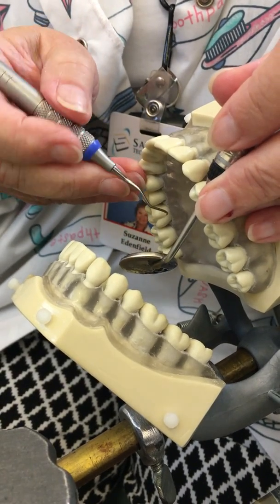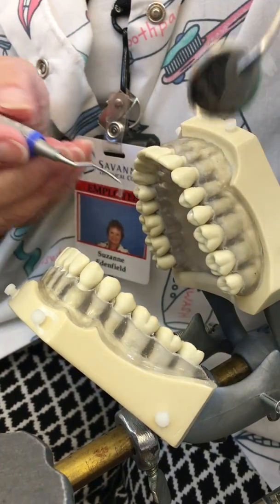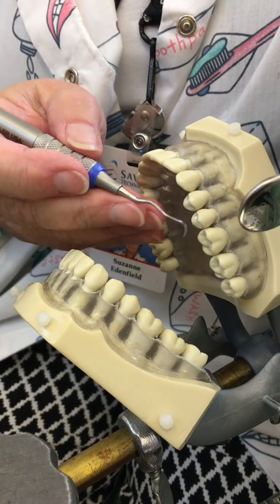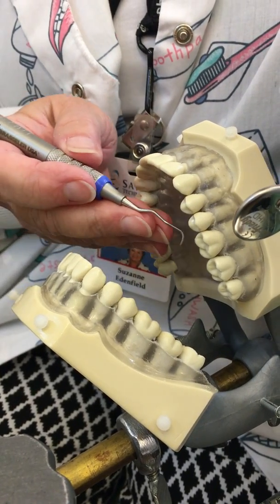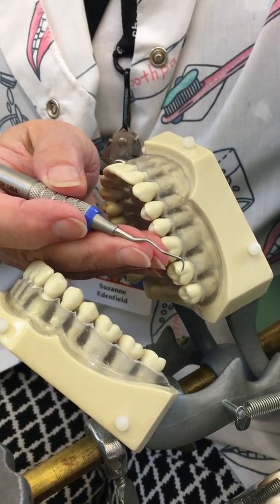My grasp is firmer, my fulcrum is firmer. Now for area four, I'm going to use the same end because it's the mirror image of three, and I'm just going to come across the arch with my palm parallel to the arch.